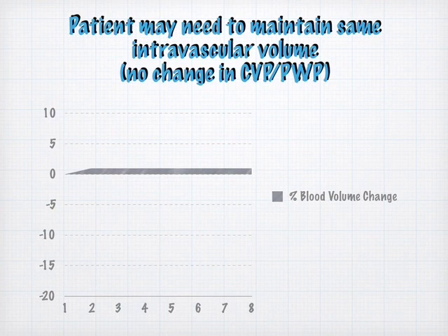This also could be, though, that I have a patient who's a trauma, a patient who's septic, somebody who's just third spacing a great deal of fluid. I have put patients on dialysis and I'm not removing fluid at all on them, and yet their blood volume is actually going down. I've seen patients, the curve on this graph here would be actually going down because they're third spacing fluid actively, despite the fact that I'm not removing anything. So on those patients, if they were at the wedge and CVP and intravascular volume that I wanted them to be at, then I actually needed to be giving fluid on dialysis to maintain them at that intravascular volume that I wanted them to be at.